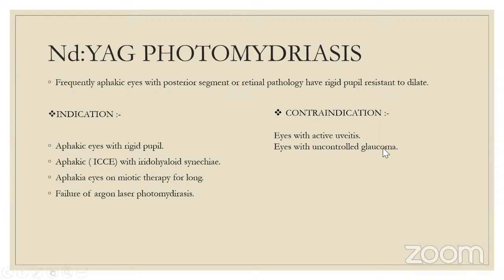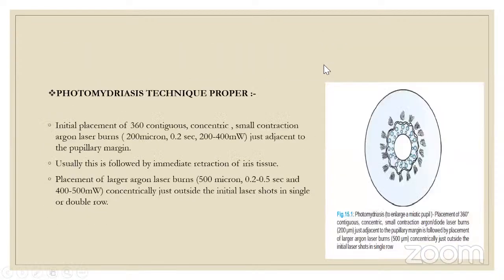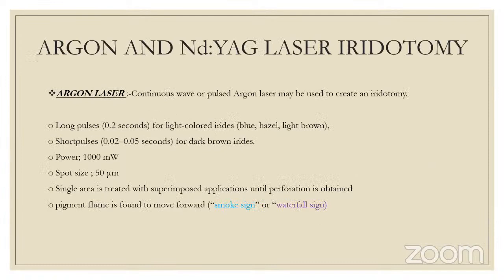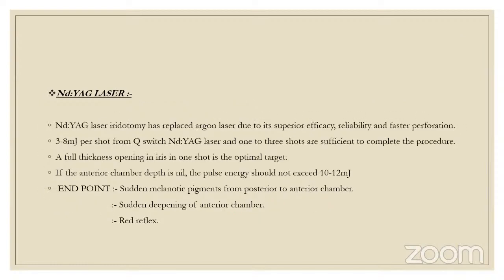Okay, Kishan, done? Yes, sir. Okay, good. So go back to the slide of laser PI. When do you use argon? We don't use argon, so I think you are still using the old term. Nowadays it's not useful to use the term argon laser because we don't use it. What laser do we use? Double frequency Nd:YAG laser. So never use the term argon laser in future. It's historical only.